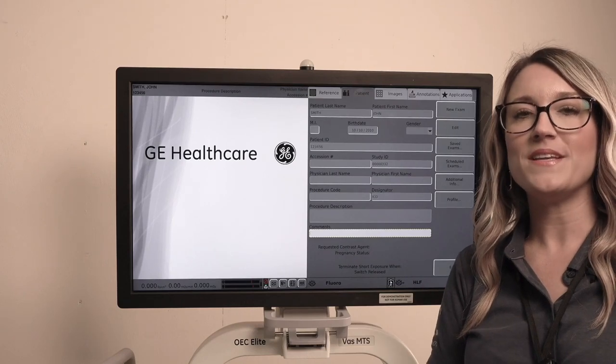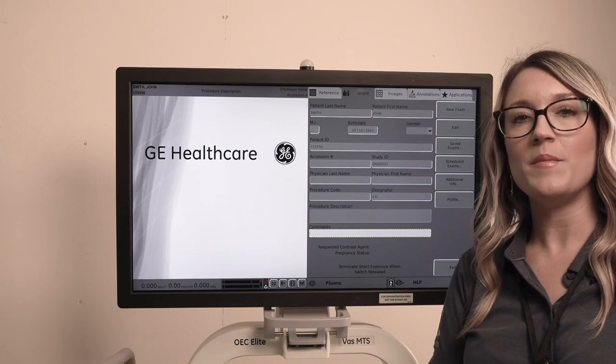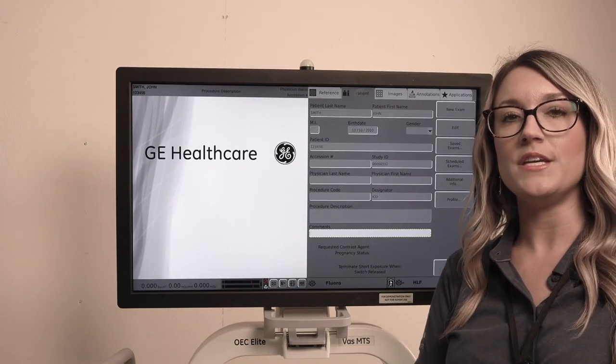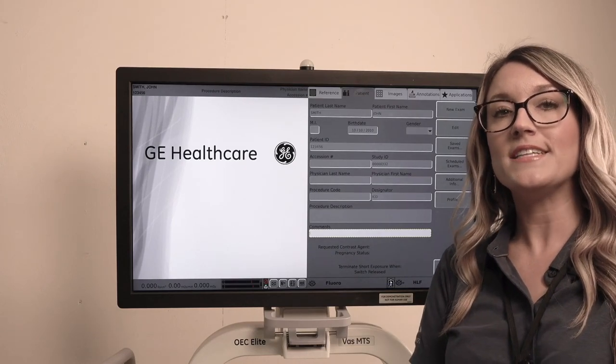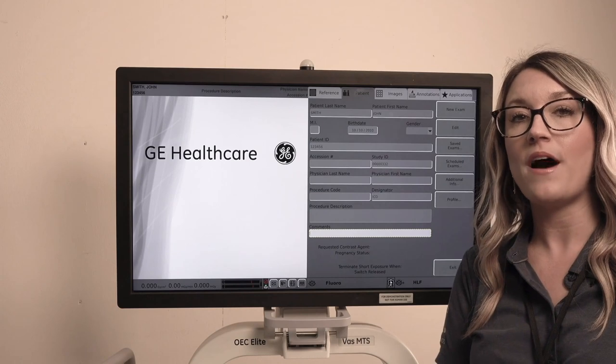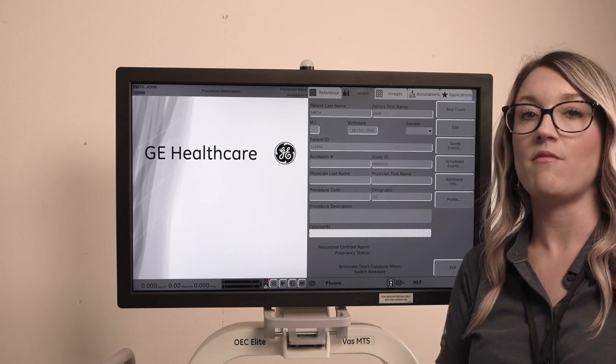Hi, my name is April Beasley. I'm a clinical imaging specialist with GE Healthcare and today I'm going to show you how to set up a CINE run.